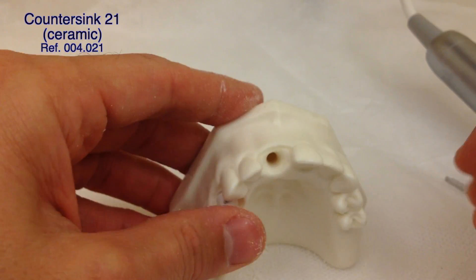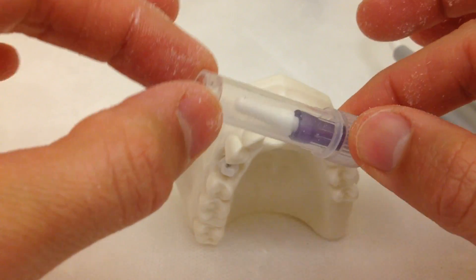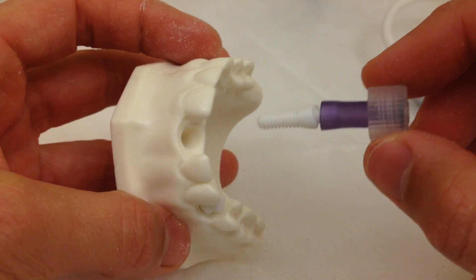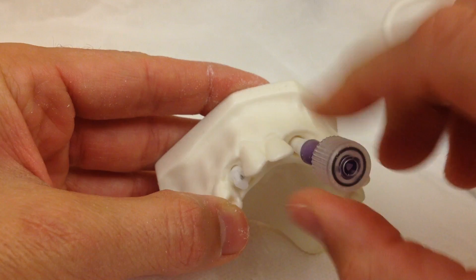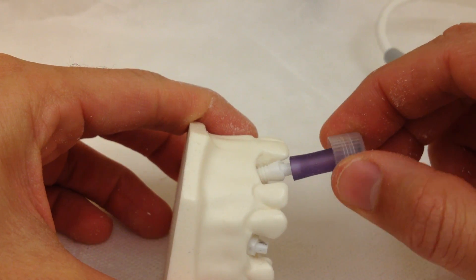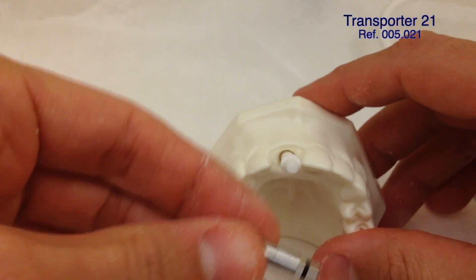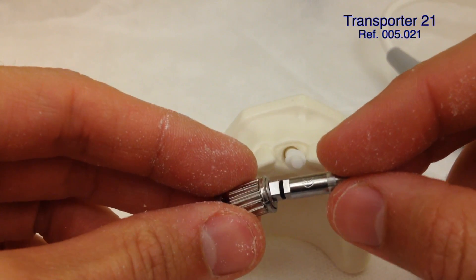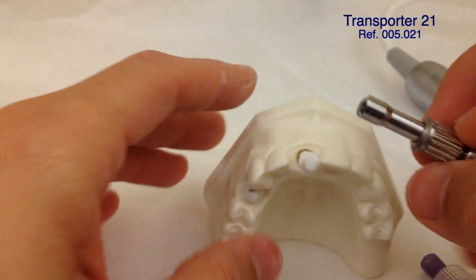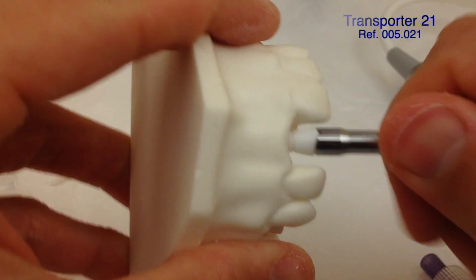Now we're going to start screwing the implant into the socket. The implant comes in a package like this, so we unscrew the package and slowly remove the silicone cap, then start screwing the implant into the osteotomy. This is the Serarut 21 driver — we can choose either handpiece contra-angle or torque wrench. In the beginning it may be necessary to use your fingers to better control the direction the implant is following.